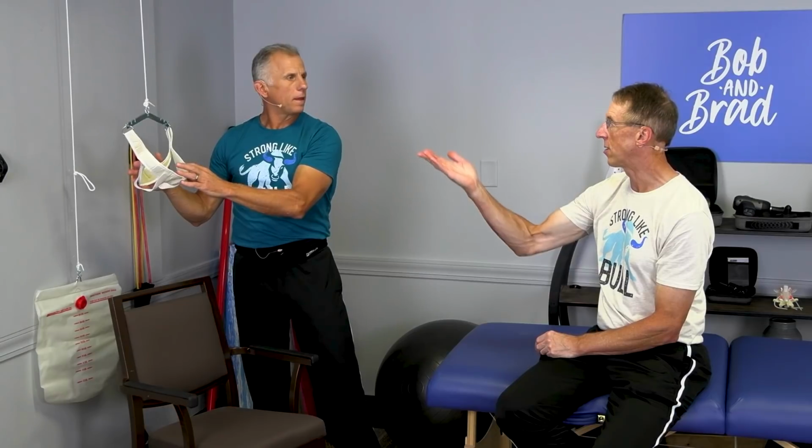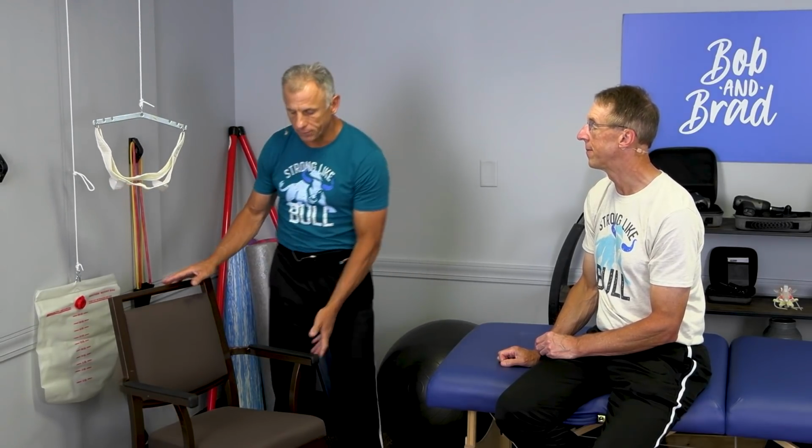If it's a short-term thing, you could try this one. I had one person, real severe neck arthritis. This offered relief. He set it up at home, and it was kind of a long-term thing. He would have been a good candidate. In that case, yeah. So we do have a video. Google Bob and Brad over the door neck traction, a complete instructional video for proper use of this.